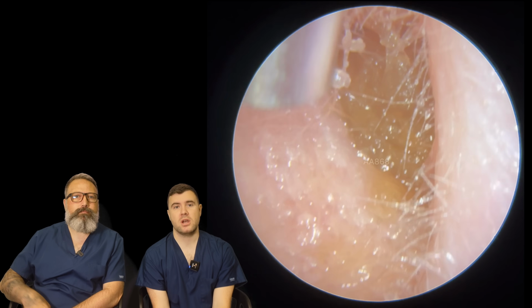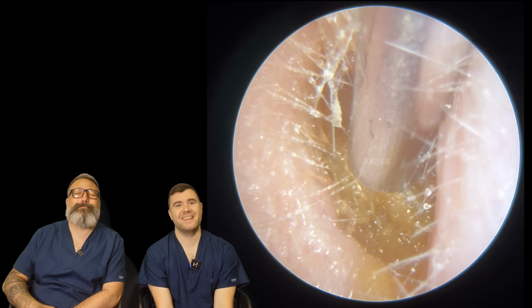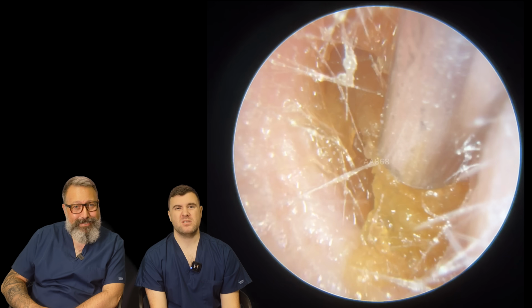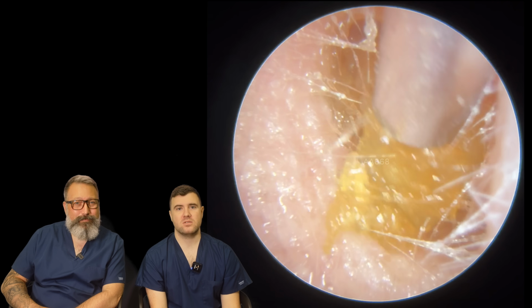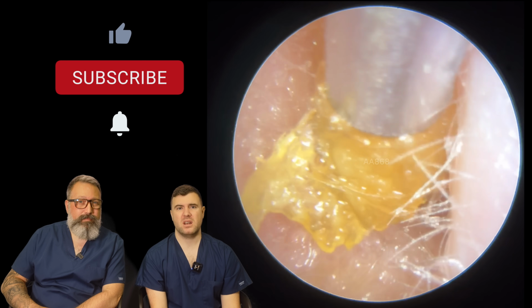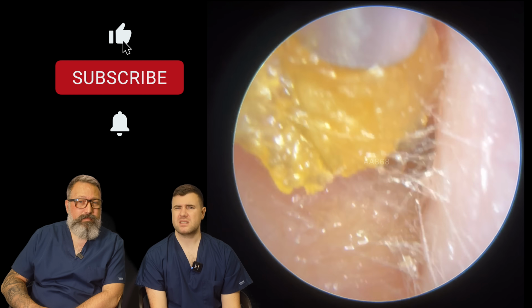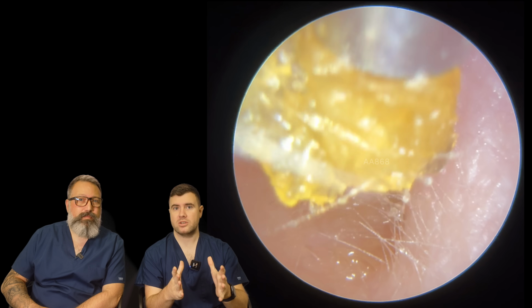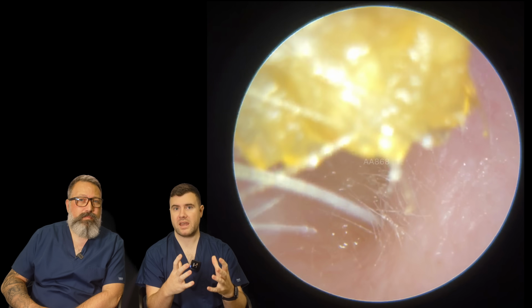We've got a really super sharp, short one for you today. S's, all the S's. Yeah. So you can see this kind of, it's almost like skin. Just a plug of skin. Standard size on the tube, I believe we've got on here. I'm going really slow here just to try and keep this whole thing together.